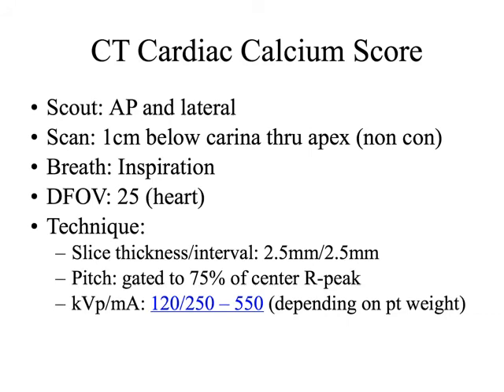So another way that we can look at CAD in the heart is just do a CT cardiac calcium score. These are pretty quick and easy exams to do. Again, we're not going to need to use any contrast to do these images, so we're just going to get a scout.